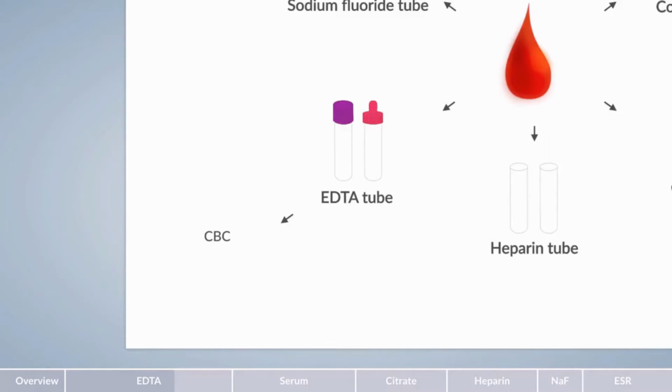The most commonly performed hematology tests on EDTA blood include the complete blood count, differential blood count, as well as blood group typing. A larger collection tube is usually used for immunohematology tests. EDTA blood is also suitable for determining hemoglobin A1C, several genetic tests, for example, single-point mutations such as factor V Leiden, and pathogen detection, for example, HIV via polymerase chain reaction, in short, PCR.